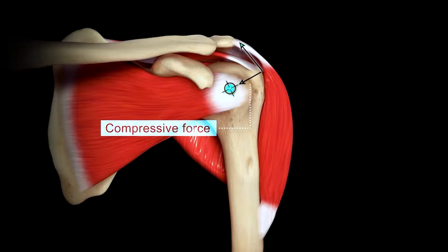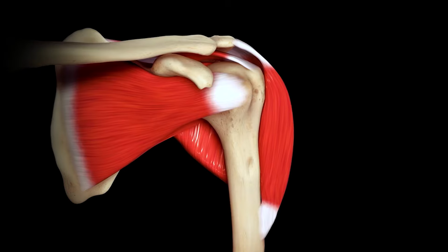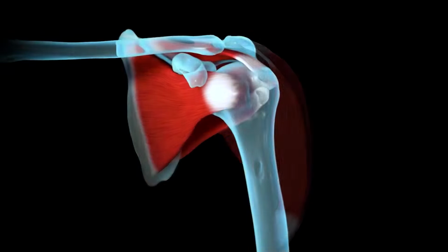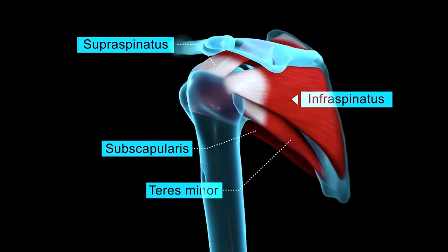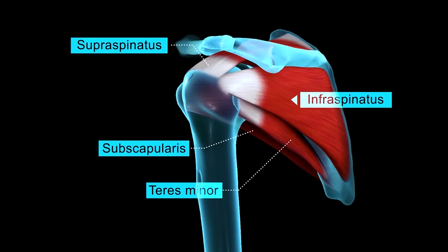The rotator cuff is composed of 4 muscles that generate the torque necessary for rotation. The anatomic arrangement of these muscles generates humeral head compression and glenoid centering at all joint positions.